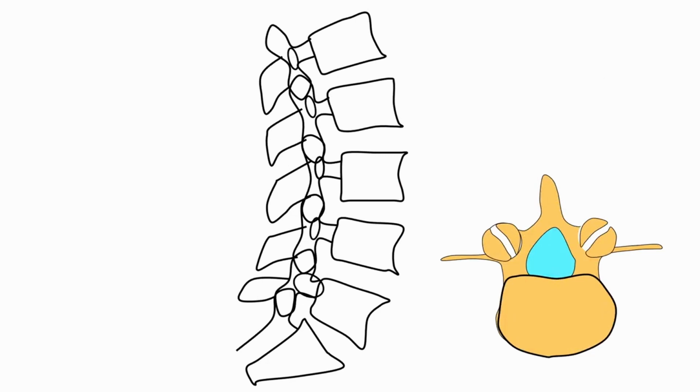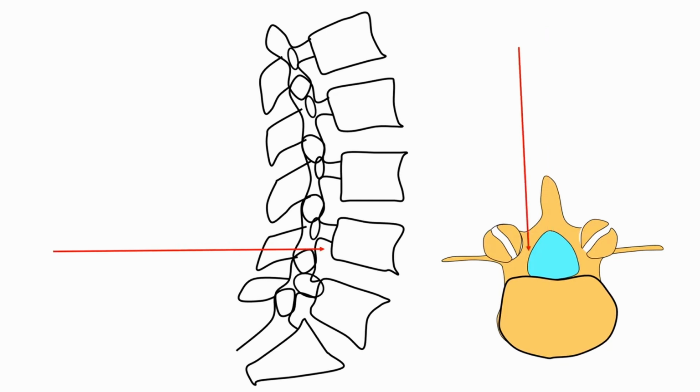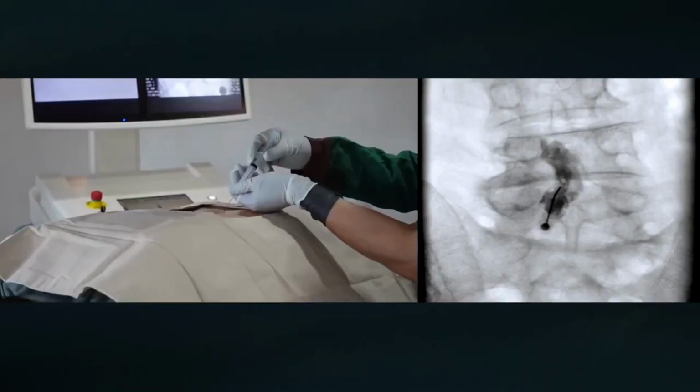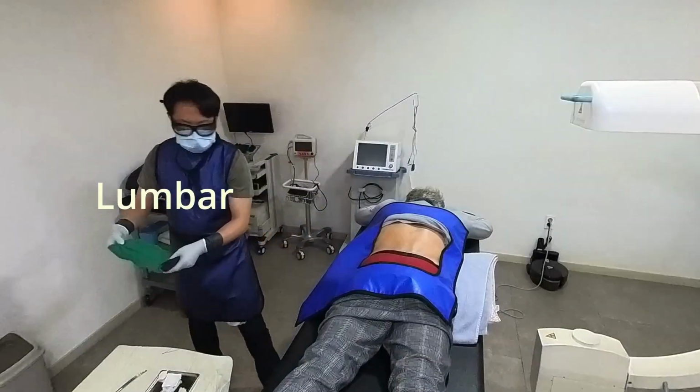The illustration showing a lateral C-arm and an axial lumbar sectional image highlights this point. If a central epidural route is chosen, it may appear that the needle did not reach the posterior epidural space. However, if a paracentral epidural route is chosen, it might look like the needle has overshot the posterior epidural space. Contrast media can confirm the posterior epidural space. Next: the medial branch of the lumbar spine.